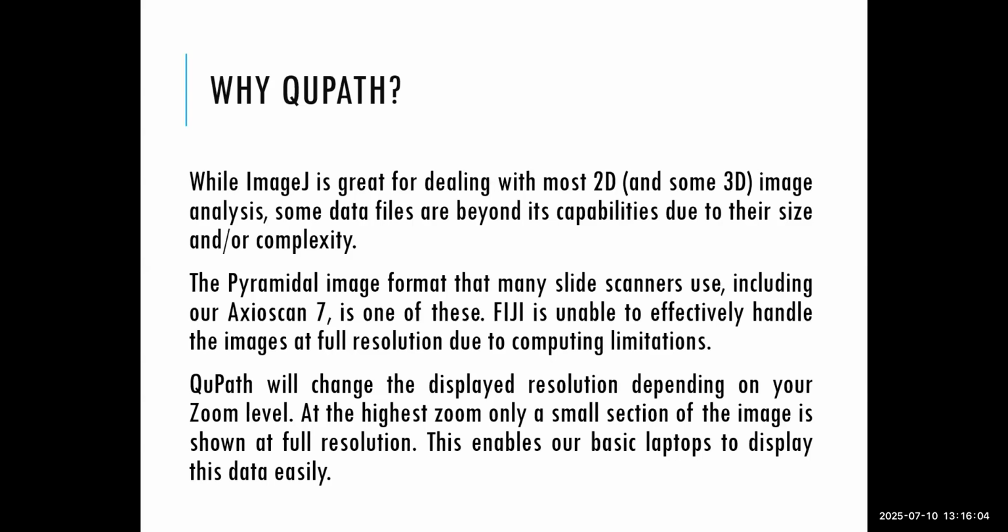However, some data files, especially very large ones, are beyond its capabilities. We're going to be using what's called a pyramidal image format, which is what most slide scanners use. Fiji cannot open these files. They are just far too massive for it to deal with. Maybe if it was a small image file, like a very small section, but if you're scanning an entire brain or something, you have no hope opening them in Fiji.